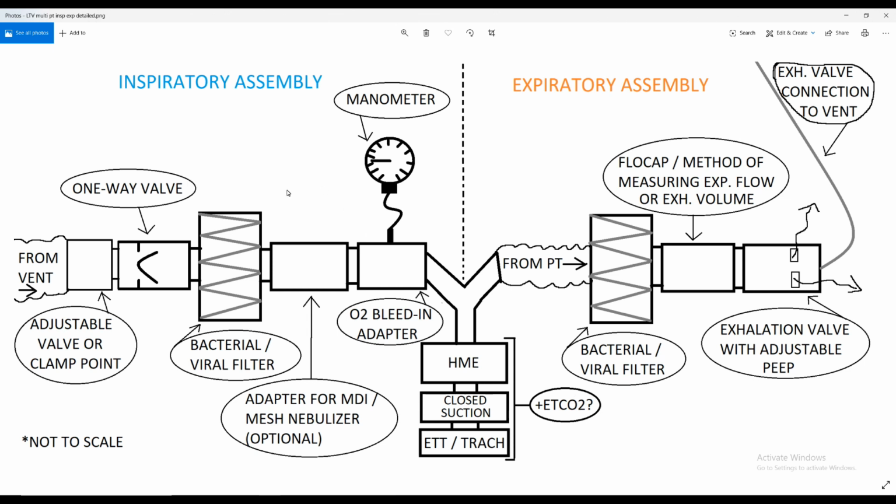Anyway, the big thing that I'm excited about, that I actually am taking a cue from one of the other videos that I watched, where I think there was actually a couple videos where people were using like what appeared to be little ball valves or some sort of adjustable valve in their setup. The way I think that would work best in this setup is to put the adjustable valve before the one-way valve. Now, what does the adjustable valve do? And it doesn't even have to actually be an adjustable valve. It could be like an adjustable ball valve or needle valve or whatever kind of valve you have on hand that's actually adjustable.